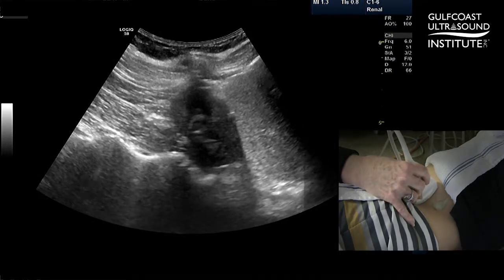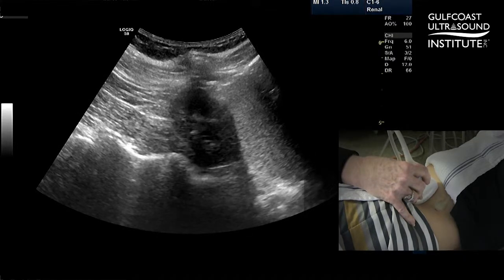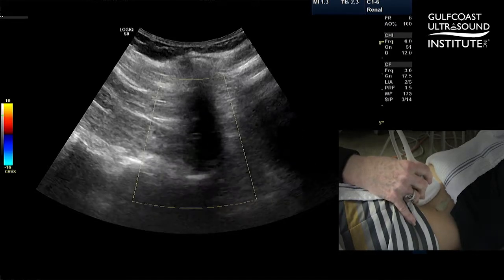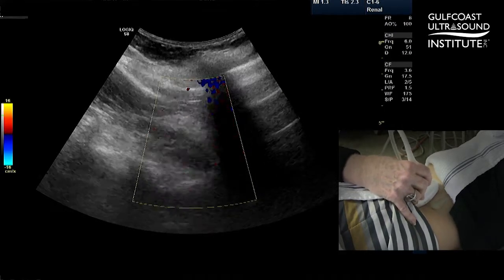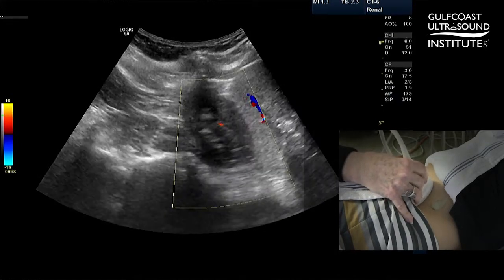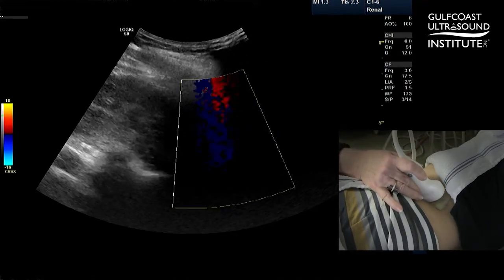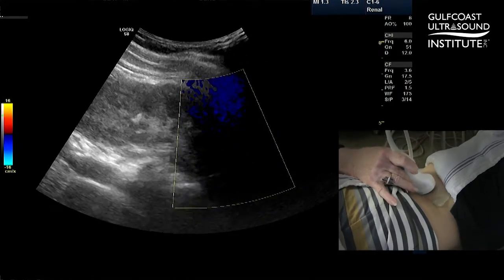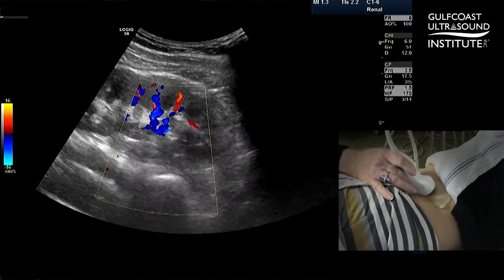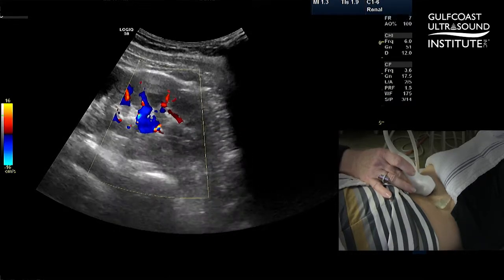I want to be able to locate the renal artery and connect it to the aorta. I'm going to go into color at this point and take a look at the transverse image of the kidney. My goal is to image the kidney in a position where I can see the pelvis of the kidney, then open the pelvis and connect the renal artery to the aorta.